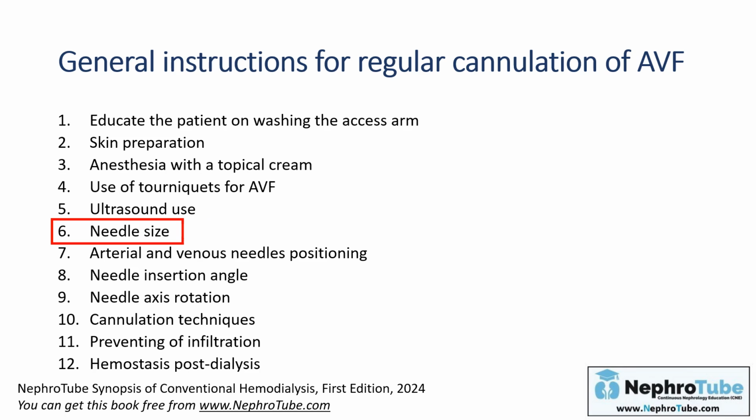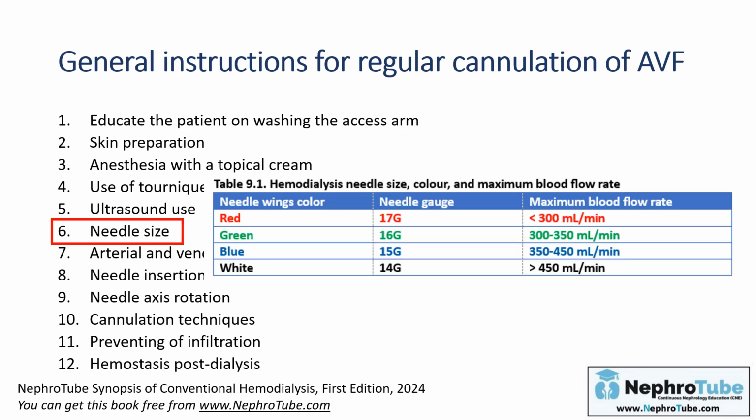Regarding needle size, first, before I go through this table, please correct in your table in the book, in the blue needle, it is written in some versions of the book from 150 to 450. No, it is from 350 to 450. Correct it as I am showing you here. If the version of the book you have is corrected already, then it is okay.